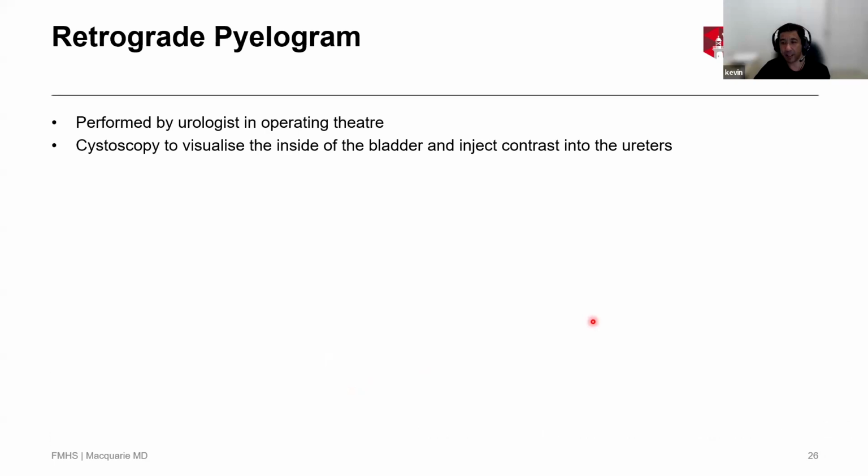Yes, it can be. So if you are imaging the base of skull or the head and neck, anything that has ferromagnetic material will cause artifact and will distort the image. If you're reliant on a perfectly uniform magnetic field and you put iron into that magnetic field, it distorts the magnetic field, and then you get distortions around the metal. That is a problem. However, if you have metal in your mouth, most of the time it's probably been there for a little while and it's pretty much locked onto your teeth. It's not going to move.